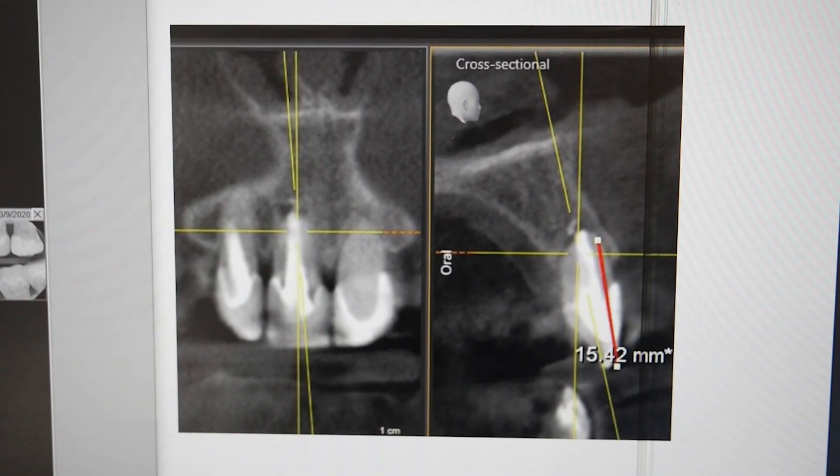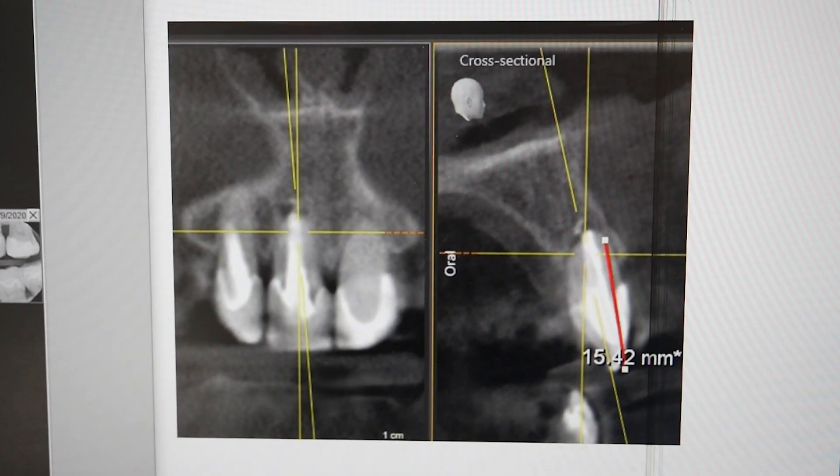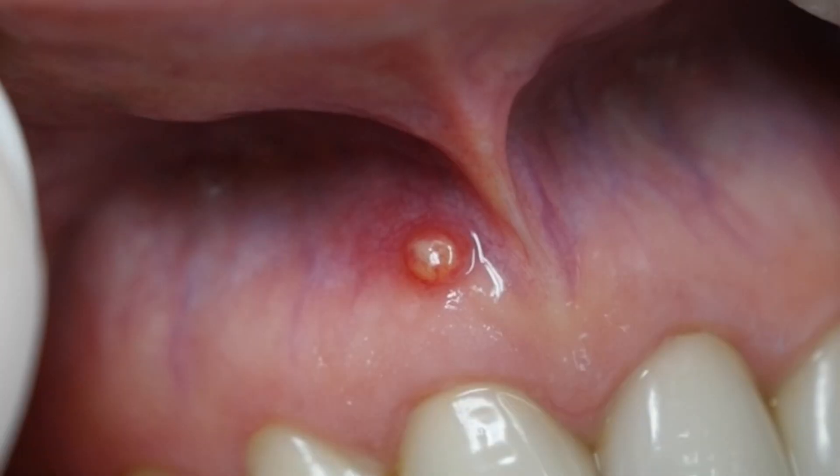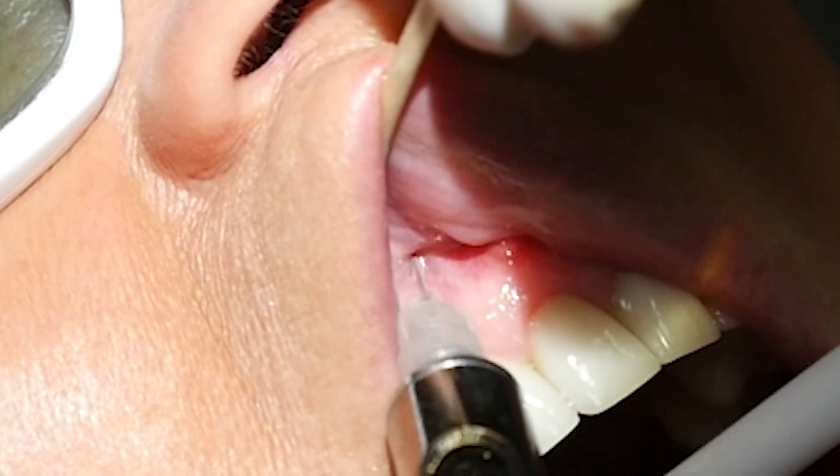A 3D scan, also known as a CBCT study, is performed, establishing the exact location of the lesion. The short nature of the root necessitates a full flap.